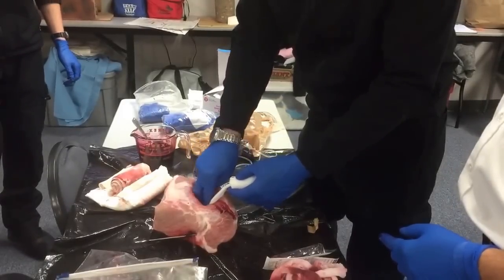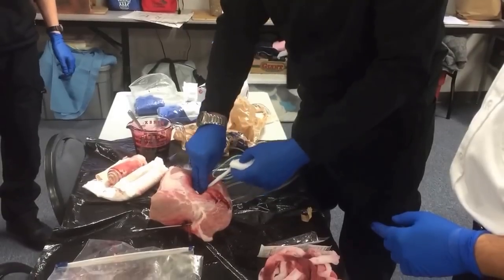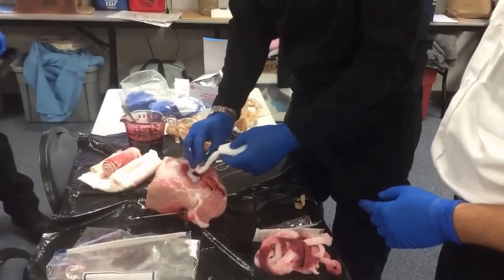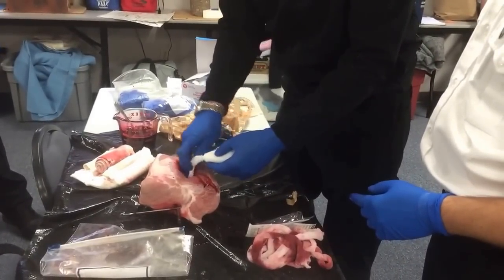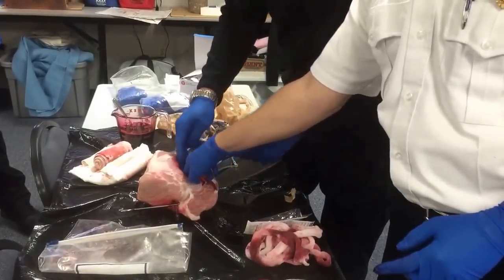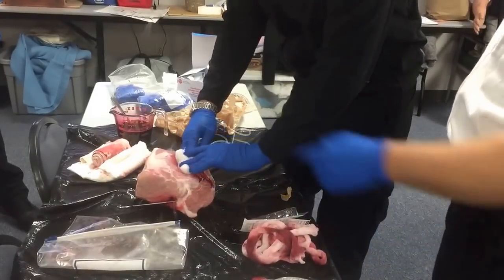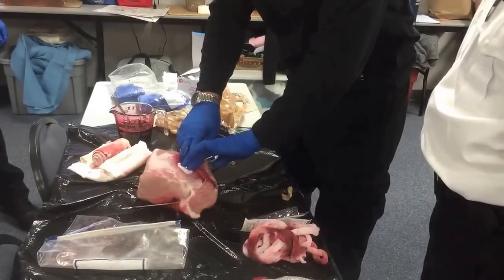Pressure directly on the vessel. It may not require the whole amount of gauze, so in that case we can take what's left of the gauze, place it on top of the wound, and bring our bandage in place.